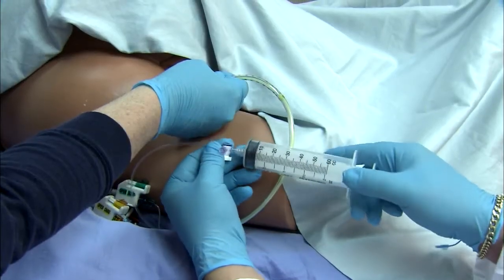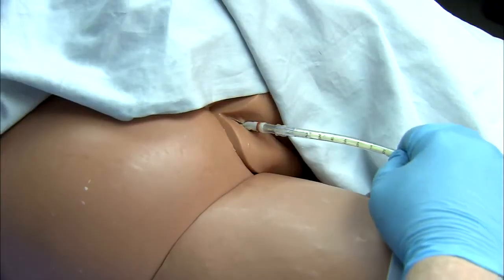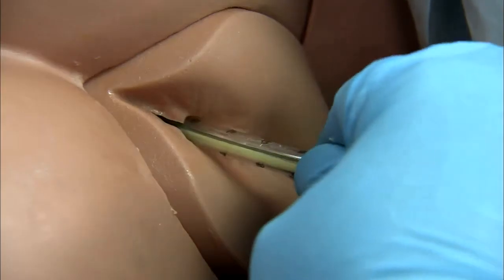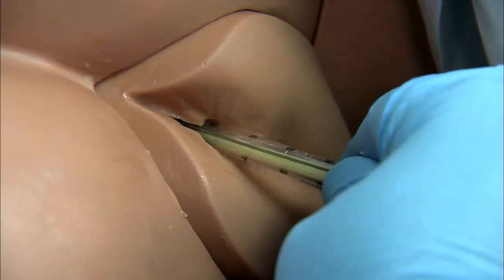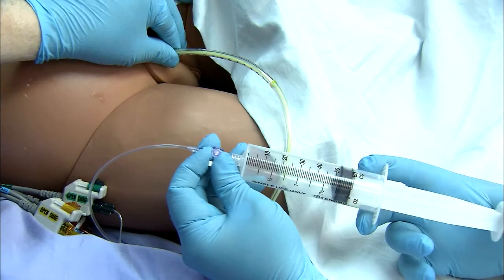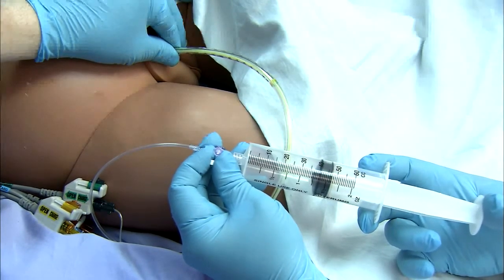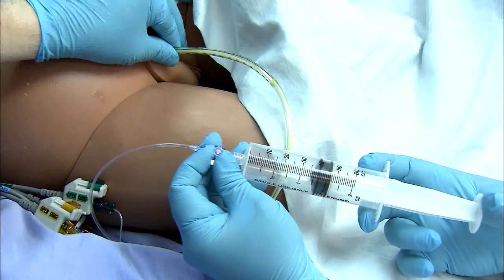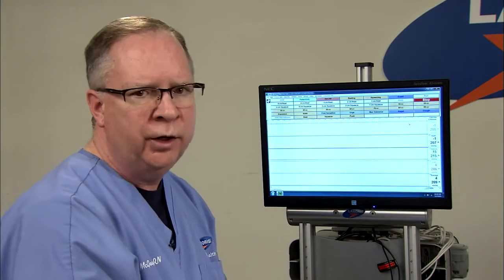The syringe is left on the stopcock. The catheter will be inserted to at least the 6 centimeter mark. We want to make sure the rectal balloon is all the way into the rectum. The assistant will then slowly begin injecting air into the balloon. Now, we don't have to go real slow, but just at a moderate pace. And you're going to be watching how much air is being inserted.